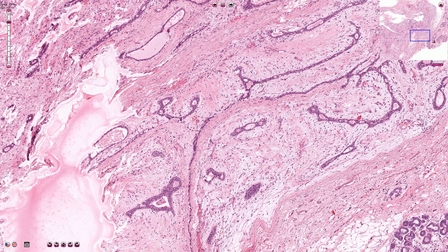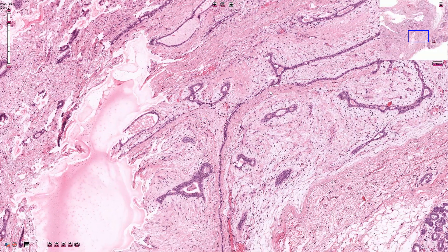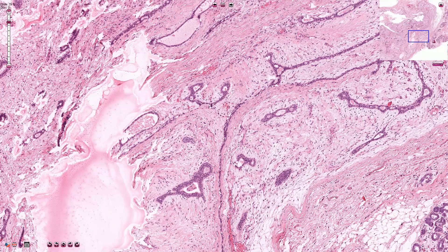We can differentiate two different patterns of the epithelial component. The more common intracanalicular pattern is where the stroma causes elongation, distortion, and compression of the glandular or epithelial component. The areas of complete compression are usually intermixed with residual lumina, which is sometimes described as a beaded pattern, as it looks like beads on a string.